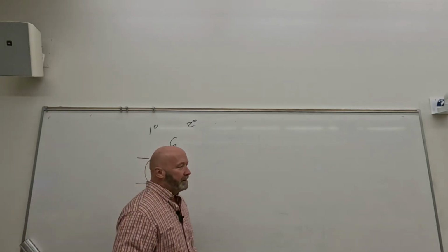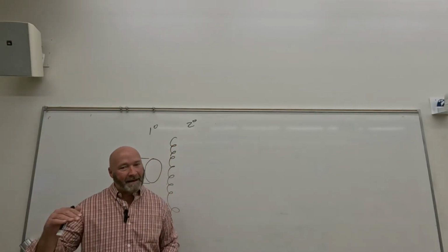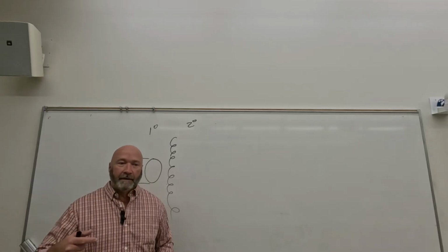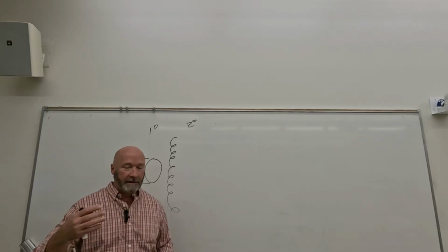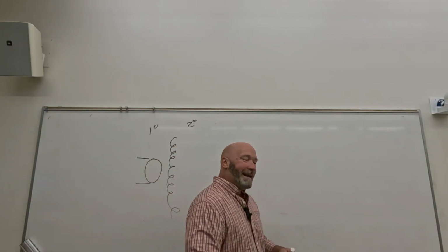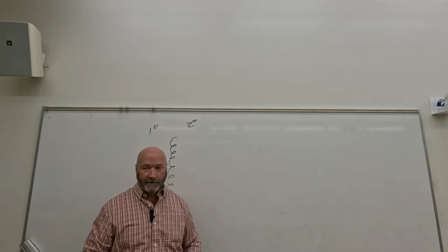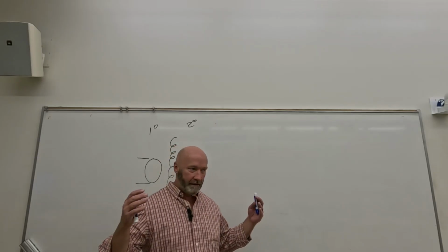So you'd never make a change of 30% if you were repeating an exam. But that's a baseline of how much you would have to change in order to affect any real change at the image receptor. If you ever have to repeat an exam, it's because you either over or underexposed the patient by 100%. So you either need to double your mAs if you underexposed the patient, or cut it in half if you overexposed the patient. And even then, between those two, underexposure is really going to be your culprit. You didn't give the patient enough dose, so the image receptor didn't get enough dose. Okay, so 30%. What is 30% roughly as it relates to a whole?